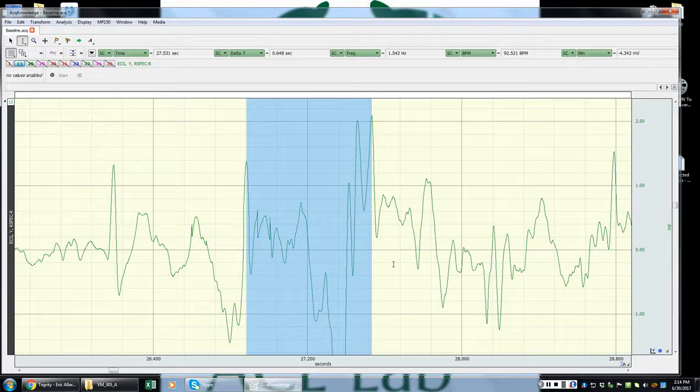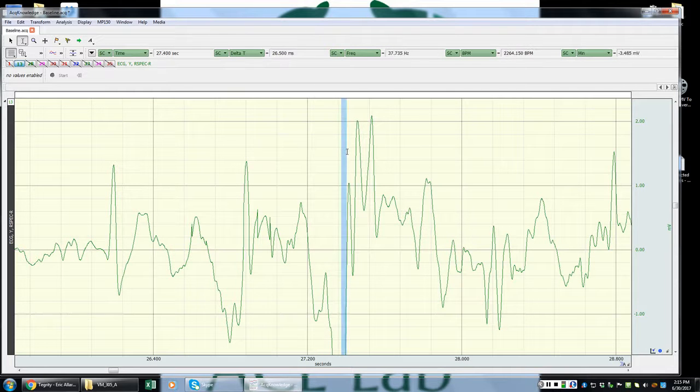Okay, so even like this one right here, even if I looked at this wave all the way over here, this little tiny notch, we're way beyond the 0.72. Okay, so even if it's not quite exactly 7.2, 7.3, 7.4, this is about a reasonable distance. Okay, so I would suggest that this is probably going to be our identified QRS peak, and it actually was. This happened to be one that AcqKnowledge determined was one of our QRS complexes. But if I was a little leery about AcqKnowledge identifying it and being confused with these ones right here, I would just go ahead and select this whole segment here and just bring it down.